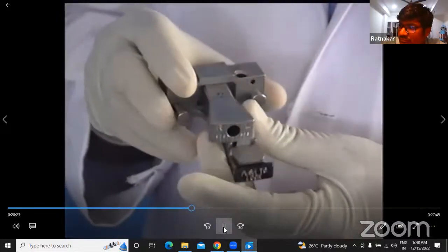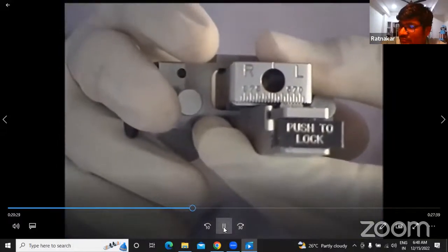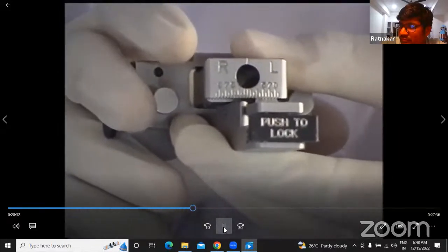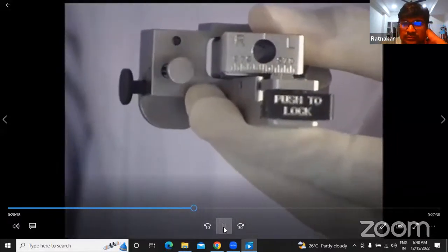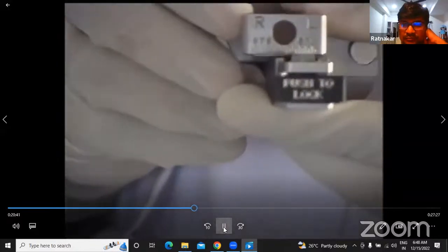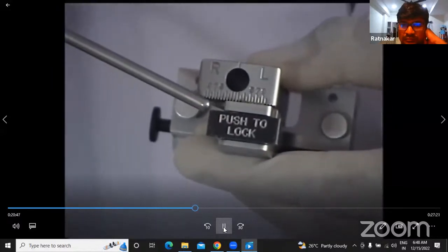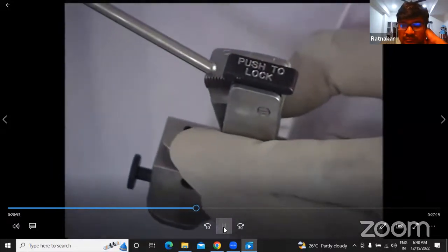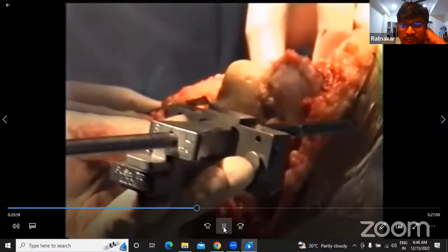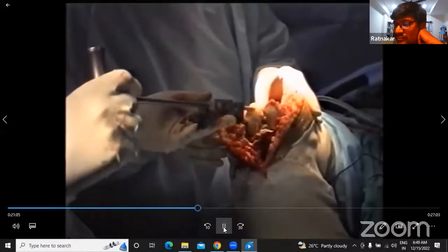This basically allows you to choose the valgus cut angle, whether it is 4 degrees or 6 degrees, which we have decided already preoperatively. It will align the intramedullary rod onto the femur. You see closely here, this is marked right and left, and you can see the markings also here, which will show you the valgus cut. That means you can cut from 0 to 11 degrees here. So this is the valgus cutting guide and femoral locating guide. This we have put at the 4 on the right side.